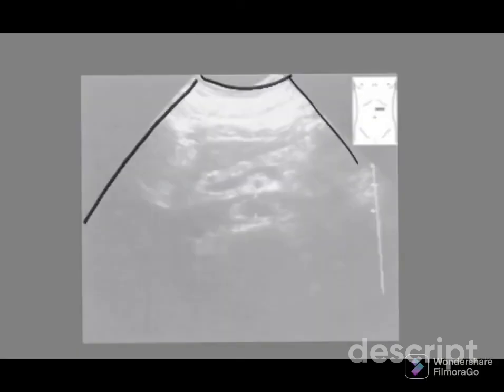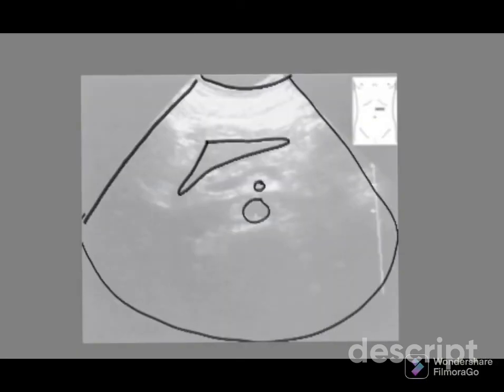Okay, so now that we have finished the transverse prox aorta, we're going to move on to the mid. Notice the mid, it's going to be in the same area as we measured in the sagittal plane. So we're going to see our SMA. We're also going to see probably a piece of the pancreas, maybe a teeny piece of the liver, but predominantly we're going to see the splenic vein that courses posterior to the pancreas there. And then in between the SMA and the aorta, we are going to see the left renal vein. If we're lucky, this isn't possible in every patient, but that's okay.